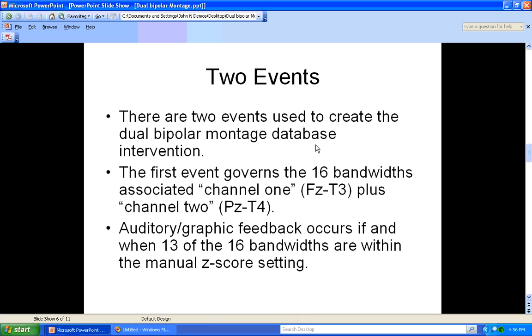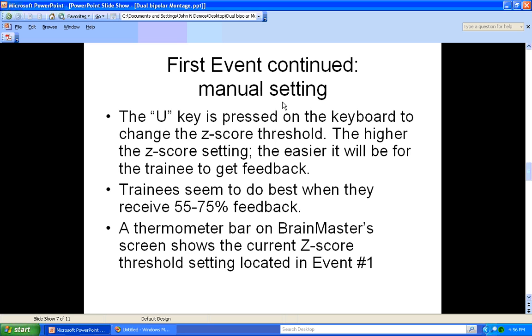There are two events used in the dual bipolar montage protocol. The first event governs the 16 bandwidths associated with channels 1 and 2. Auditory and graphic feedback occurs if and when 13 of the 16 bandwidths are within the manual z-score setting. The clinician adjusts the U key on the keyboard to change the z-score threshold. The higher the z-score setting, the easier it will be for the trainee to get feedback. Trainees seem to do best when they receive about 55–75% feedback. A thermometer bar on the BrainMaster screen shows the current z-score threshold setting located in event number one.